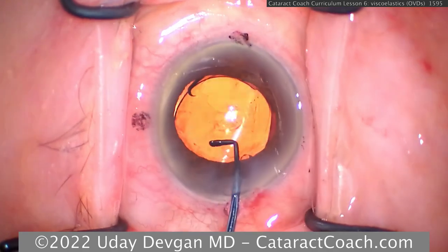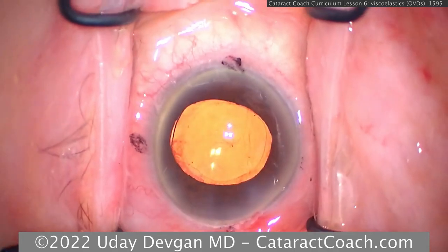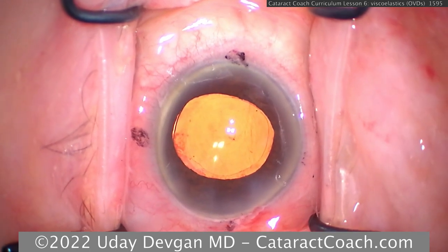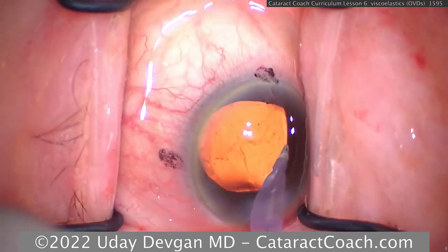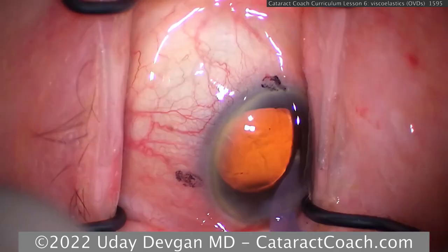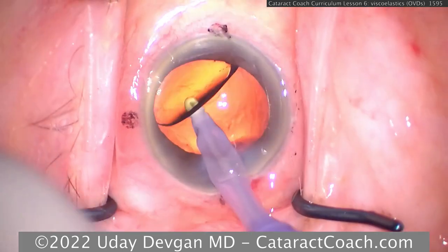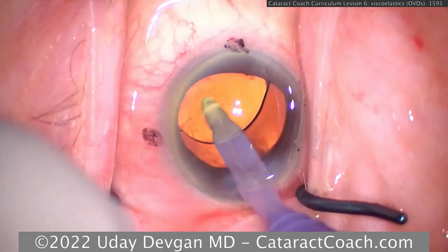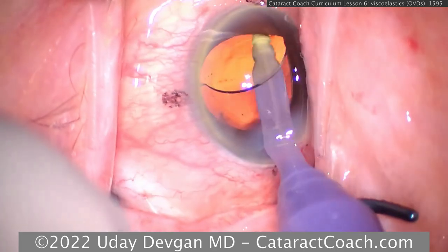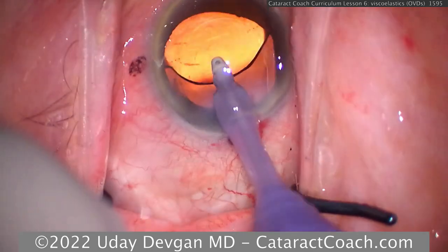Look at this case. You see the toric IOL marks at the haptic optic junction. So this is certainly a toric lens. And now look, they're also diffractive rings. This is a trifocal toric IOL. Now this IOL has to be placed at a very specific axis, and we have to center these diffractive rings exactly correct. Now this IOL optic is slightly tacky, and it'll tend to stay where we put it.